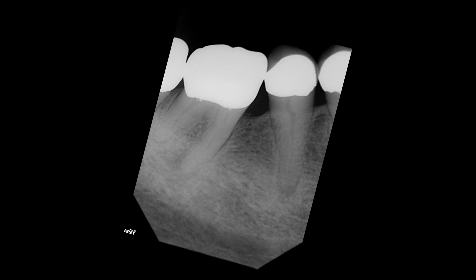Hey guys, Dr. Dobson. This is going to be a different video because I'm going to be showing some clinical footage with the audio from the procedure on how I like to give mandibular nerve blocks. Somebody asked me in a previous video how I give my inferior alveolar blocks, so this is going to be a case where we did give a quad 4 block.